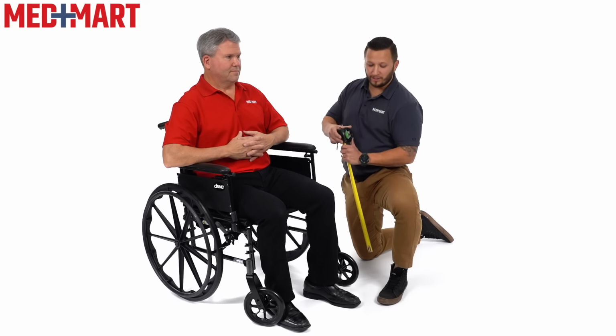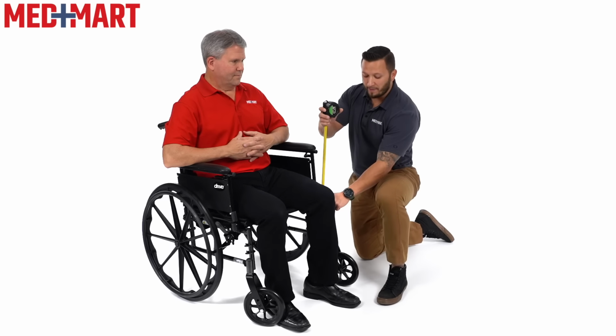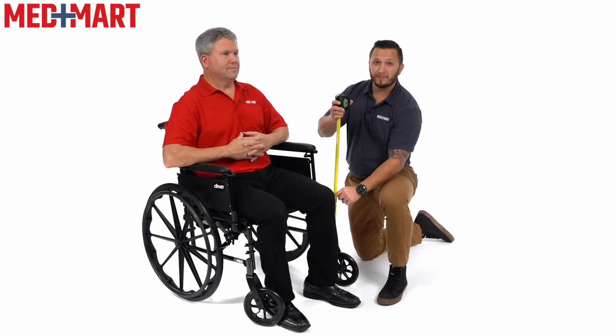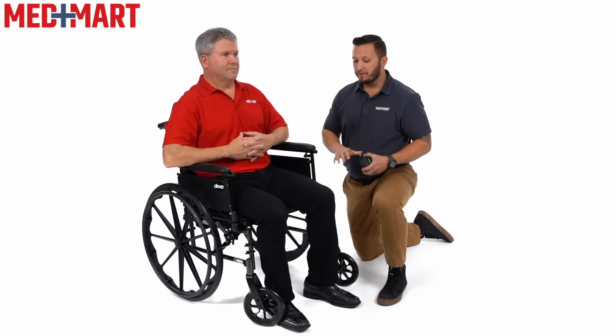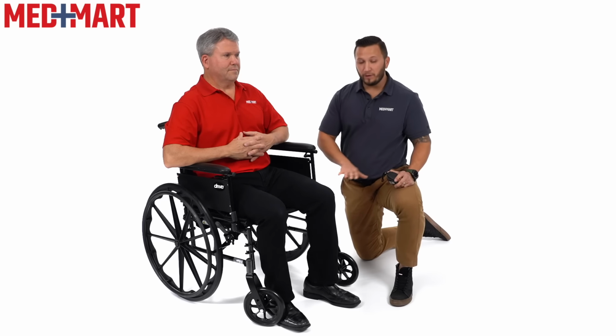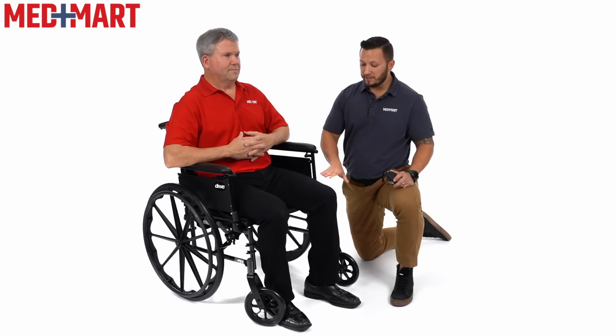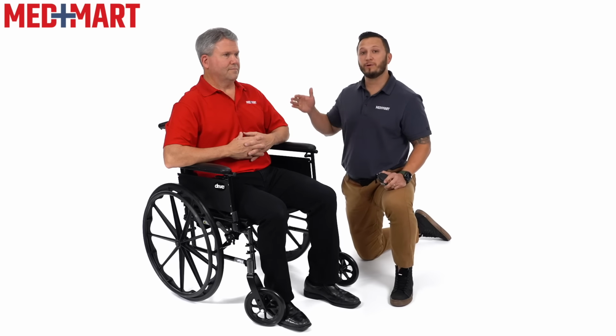Finally, to make sure that I get the appropriate seat height, I'm gonna measure from his heel to the back of his knee. That comes in at 19 inches. This chair seems to fit him appropriately because his foot is flat on the ground, his ankle is at 90 degrees, his knee is at 90 degrees, and his hips are at 90 degrees.